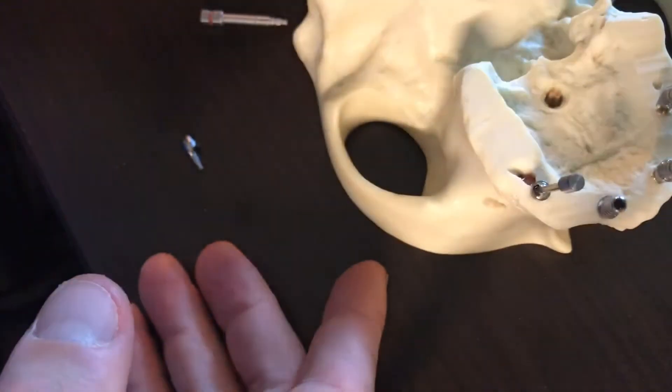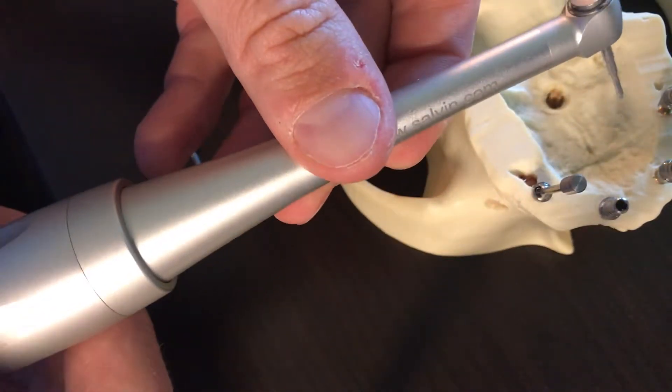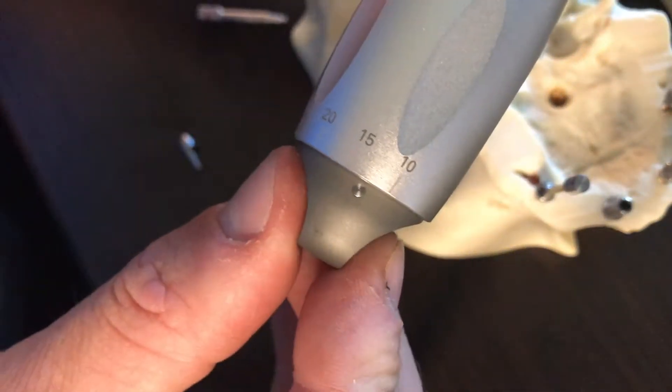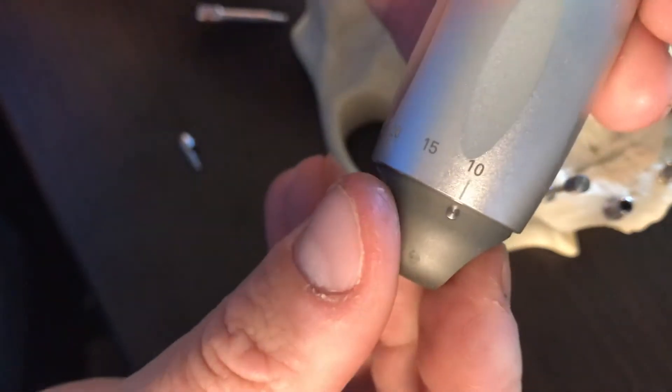We're only working on a model, not in the back of the mouth, but this is a great tool if you want to be a great rep, not just a good rep. Here's an extra-oral torque wrench. On the back end, I've actually set it between 10 and 15. The doctor may tell you to go less and then turn it up.